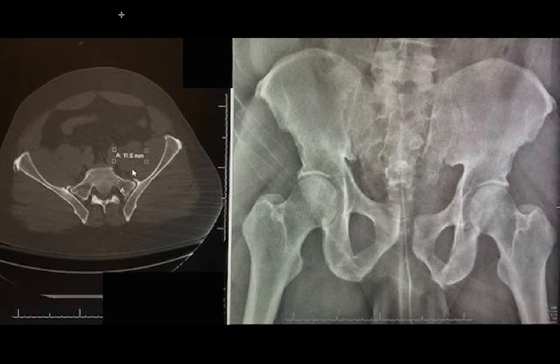So this is a patient that was struck from the side. The important thing to note on this x-ray, even though it's not a true AP, it's rotated, but it's pretty close. You see the spinous processes, and they line up here with the intact symphysis. So it's a pretty good judgment of rotation. And you see obviously that there is a discrepancy here in the symphysis.